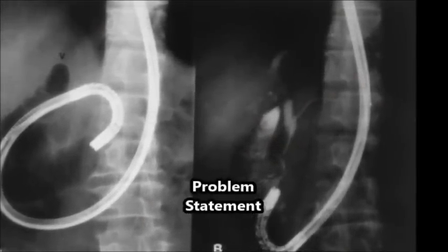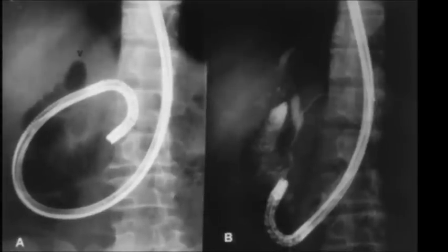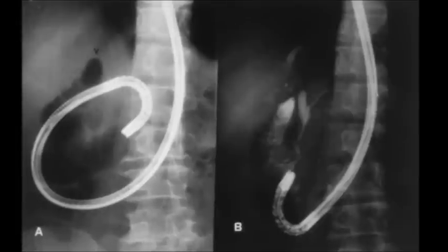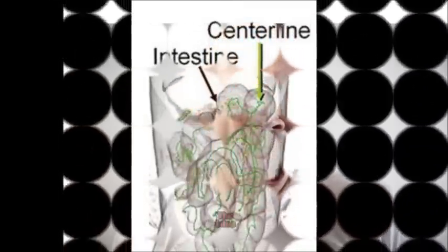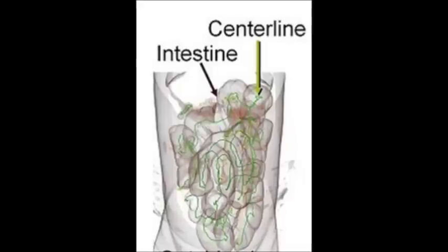However, the doctor may encounter problems when the endoscope gets tangled up, and this causes excruciating pain for the patient. It is difficult to untangle the endoscope without knowing its spatial configuration, as well as due to the boundary conditions in the human body, which is very narrow. The tangling of the endoscope must be avoided in the first place. The problem can be solved if a localization method is employed.